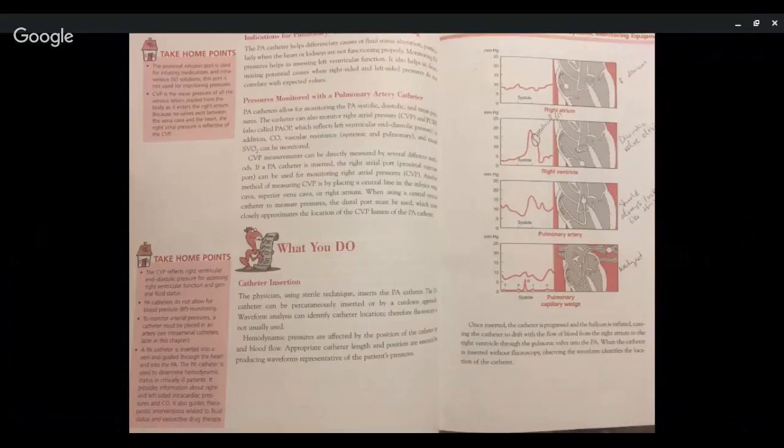Indications for pulmonary artery catheter monitoring. The pulmonary artery catheter helps differentiate causes of fluid status alteration, particularly when the heart or kidneys are not functioning properly. Monitoring pulmonary artery pressures helps in assessing left ventricular function. It also helps in determining potential causes when right-sided and left-sided pressures do not correlate with expected values.